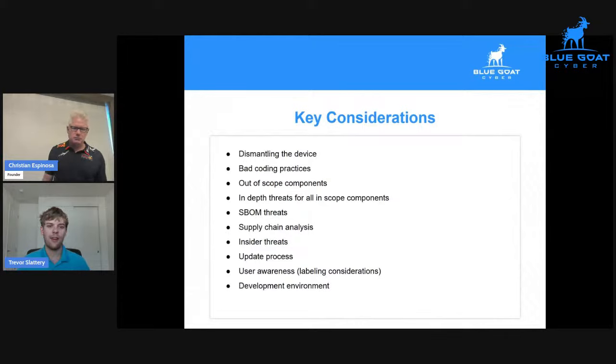First being, it's just very important, and you can introduce a lot of really severe risk through vulnerabilities in the code. The second being, it often takes a long time to fix problems identified through bad coding practices. So when we're threat modeling, we're thinking what could happen and verifying whether or not it does happen. Usually this one does happen. So this one can take a lot of time, oftentimes months even, to fix. So we want to catch it as early as possible and shift that threat modeling process to the left as much as we can to identify these early on.